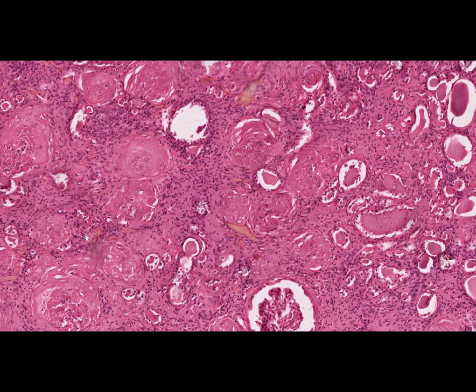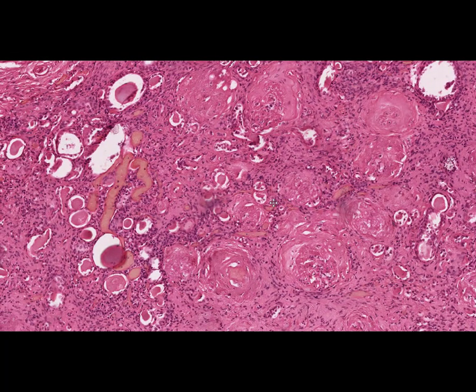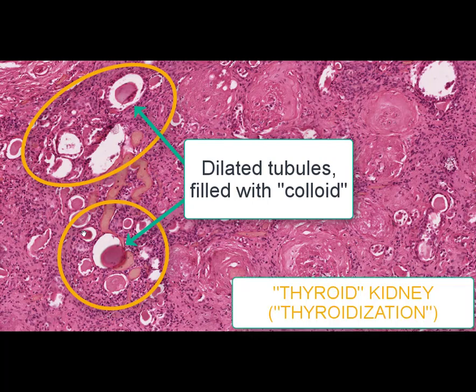As the tubular-interstitial elements are affected primarily, the main changes are found in renal tubules. Most of the tubules in this slide are dilated and filled with homogeneous eosinophilic masses which have the appearance of colloid. The tubular epithelium becomes flat, with atrophy and degenerative and necrobiotic changes. Such microscopical appearance is commonly called thyroidization or thyroid kidney.